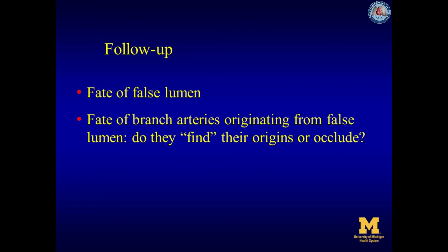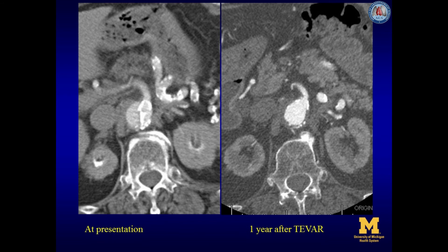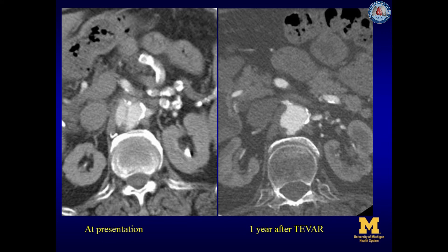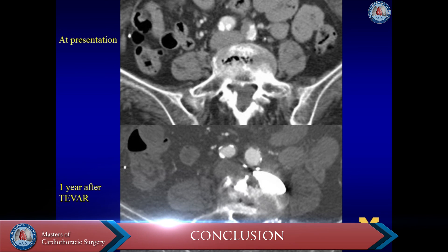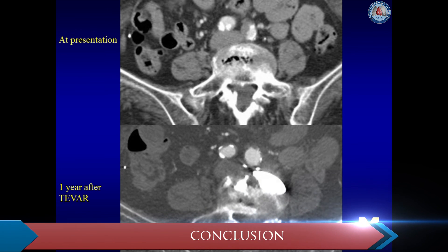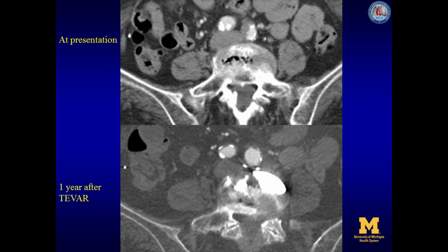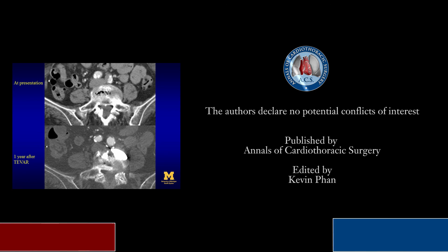During follow-up, it is important to evaluate the false lumen and the branch arteries originating from the false lumen. The collapsed true lumen at the level of the superior mesenteric artery origin at presentation — marked by atherosclerotic intimal calcium — is completely re-expanded one year after TVAR. At baseline, perfusion is seen in both the true and false lumen; one year after TVAR, perfusion is seen only in the true lumen with well-perfused kidneys. At presentation the left common iliac artery was dissected; one year after TVAR, true lumen expansion of the left common iliac artery was seen. This concludes our presentation of how acute type B aortic dissection with malperfusion is managed with TVAR in our institution.